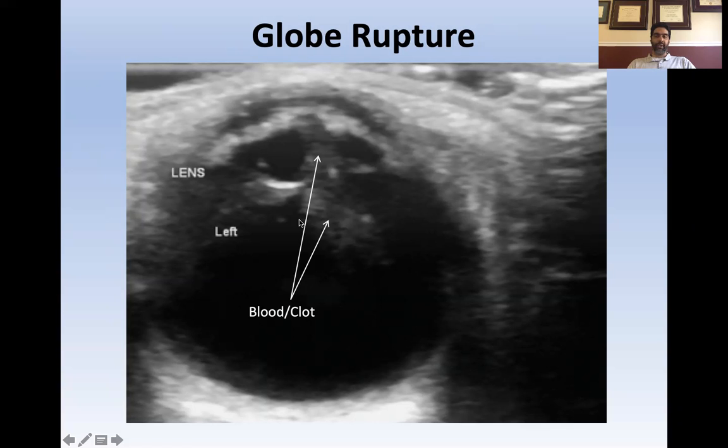This is the result of blunt trauma. You can see up here there's some edema there, and then a fair amount of soft tissue in between. So this is an eyeball that was essentially swollen shut, and the ability to get a good eye exam was not that great here. And again, what you don't want to do is try and pry open the eyeball to get a look at it. So what you can do is just put an ultrasound probe on very lightly, and you can get a really good look at stuff that's going on posteriorly.